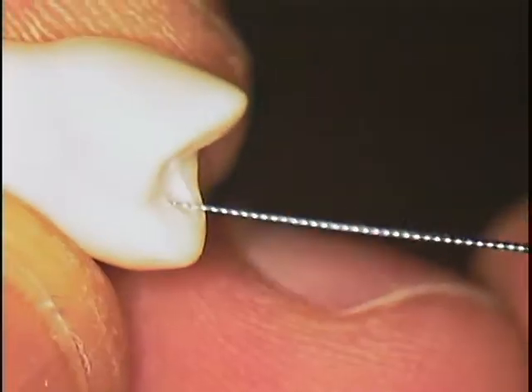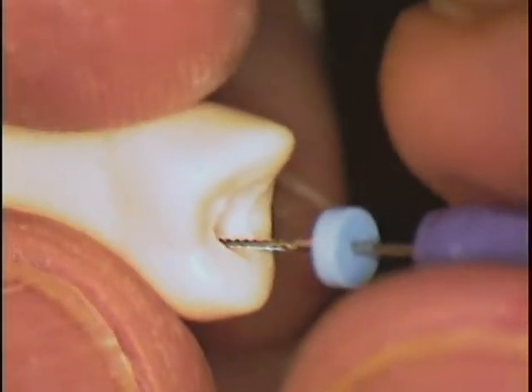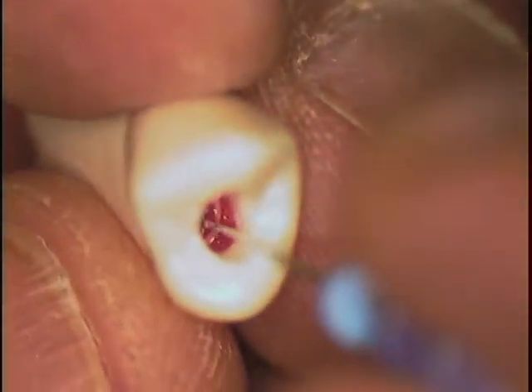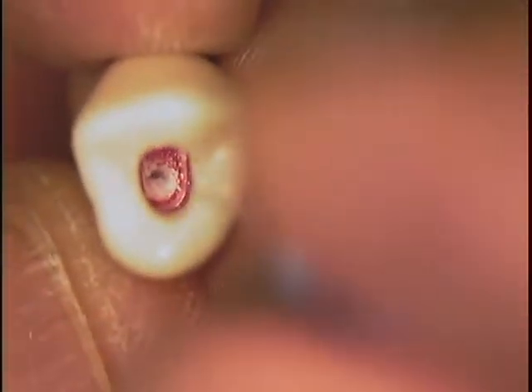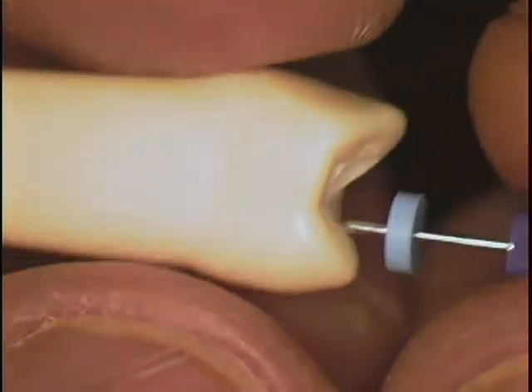I'm going to do the same thing for my lingual cusp. Okay, and I'll measure that. Now, if I find I'm really tight in here and I'm not going all the way through and it's just binding, then there's something wrong, and you might have cut through to the side. You might be creating another canal. So if that happens, stop one of us. We'll come by, take a look.